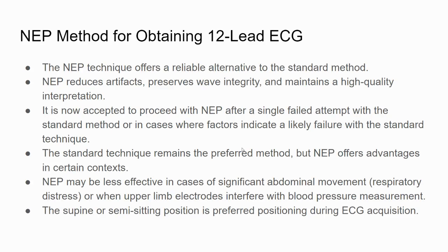So this is a reliable alternative placement to the standard method. It's said to reduce artifact, preserve wave integrity, and maintain a high-quality interpretation. So depending on what material you read from the MSSS, there was a notice that was sent not too many months ago stating that we will directly go to the NEP method after a single failed attempt with the standard method. So again, you attempt to put the standard lead placement, you're getting a lot of artifact.